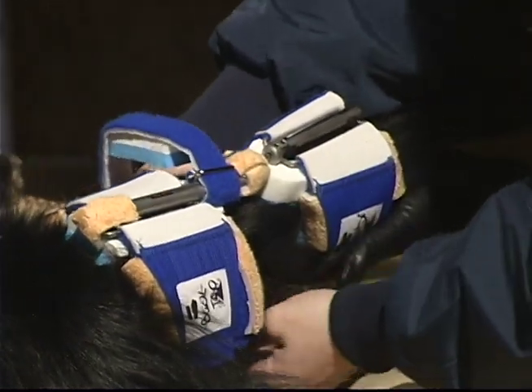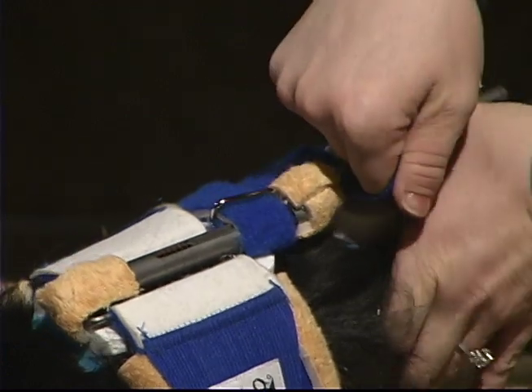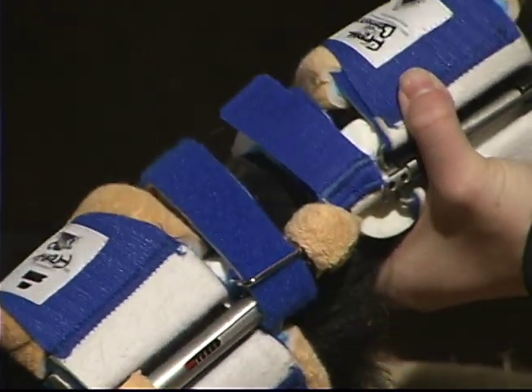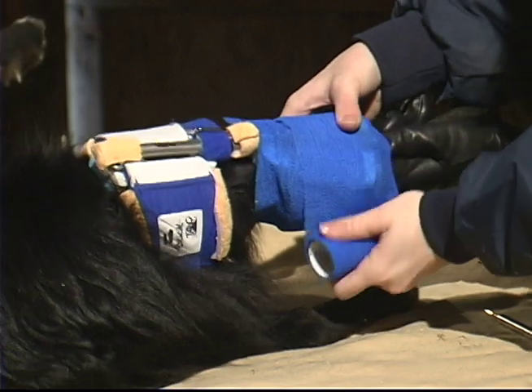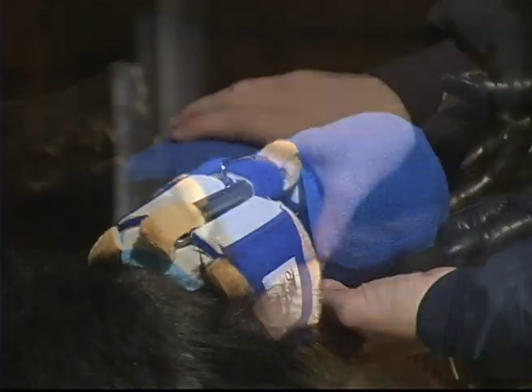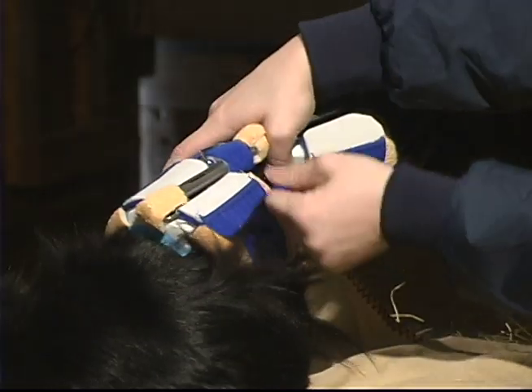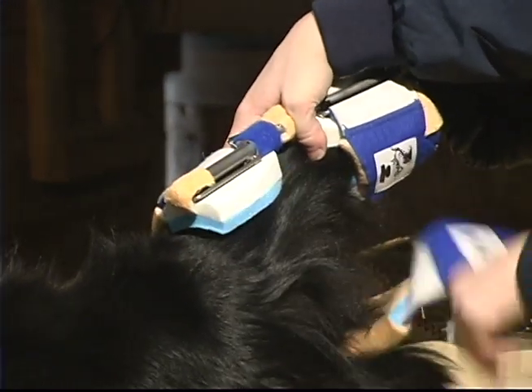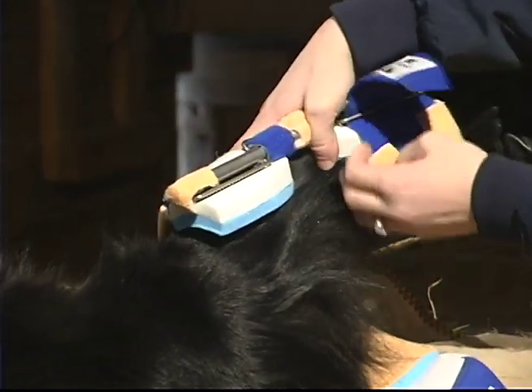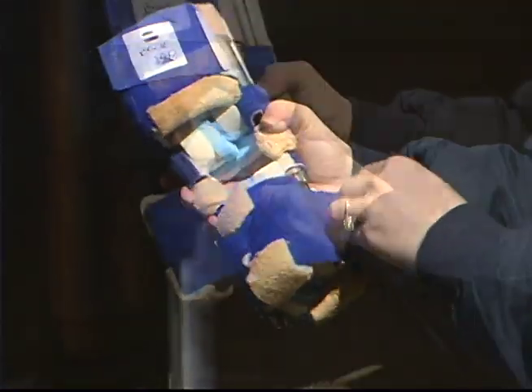Once the splint is tight on the leg, bring the counterforce straps around the front of the leg, looping them under the opposite strut and pulling snug. Add vet wrap to the top and bottom cuffs to prevent the splint from slipping and discourage chewing. To remove the splint, first remove the vet wrap, then undo the back top cuff and back bottom cuff. Once the splint has been removed, be sure to fasten all the Velcro straps in order to maintain the proper orientation.